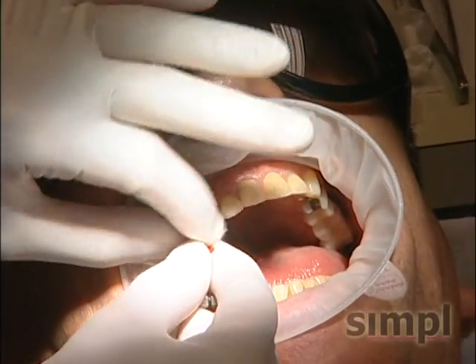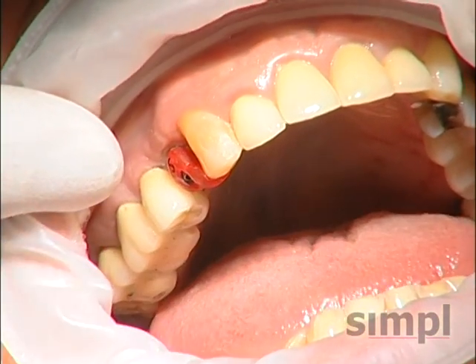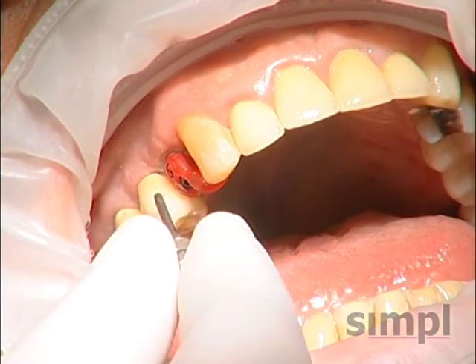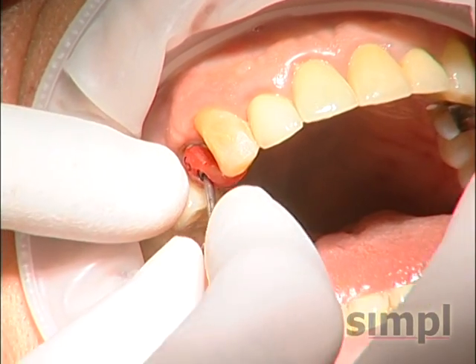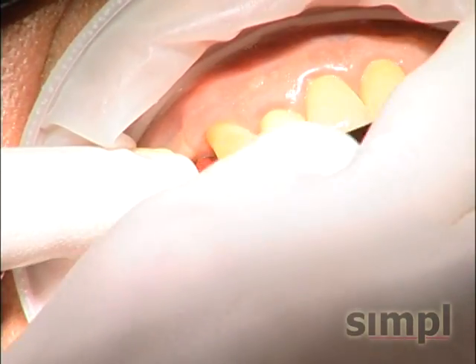Watch how we place it in the mouth. We use the jig to rest it on the adjacent tooth. The tooth is indicated on the buccal, number 5. It fits right into place. We can now just tighten manually all the way down.